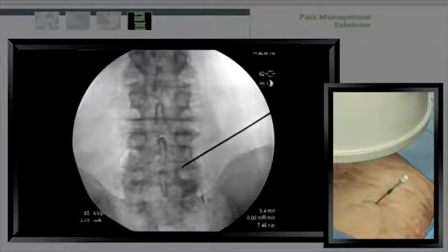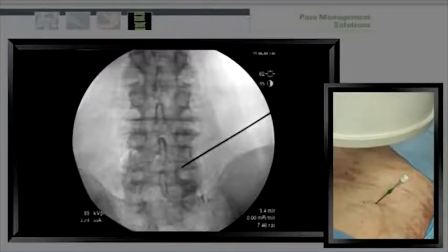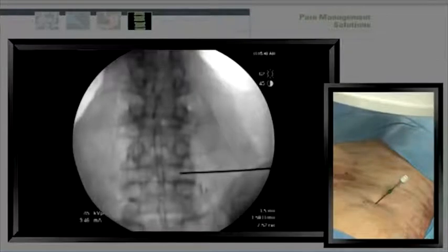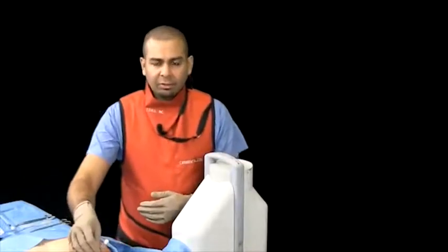We're going to go back into a tilted position to ensure that we've achieved enough depth, and also to confirm that we remain lateral to the mid-pedicular line. And this is an optimal position for this procedure. You'd want to place the left-sided needle with a similar technique as the one used on the right side. Certainly there's no need to reinvent the wheel.